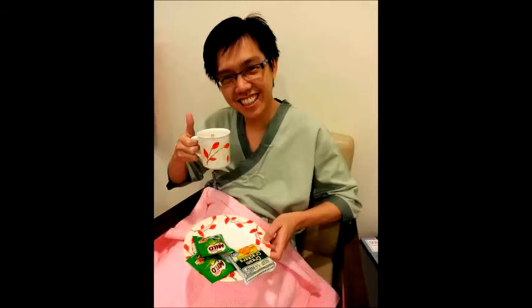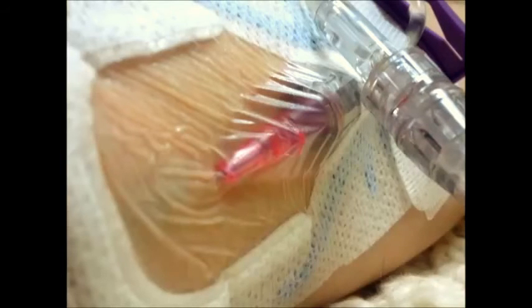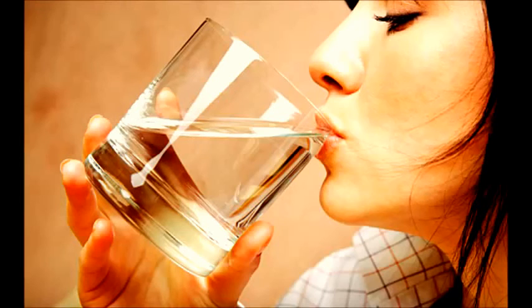We need to keep the intravenous line for more than half an hour for observation because some of the patients may have late allergic reaction. You are also asked to drink plenty of water to excrete the contrast media out of the body.